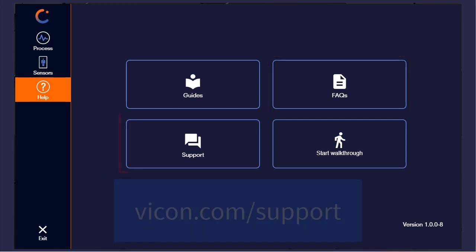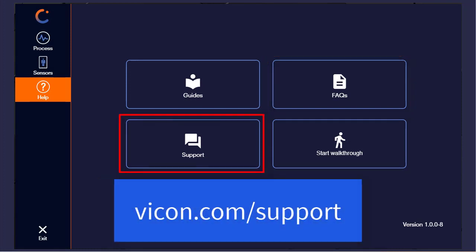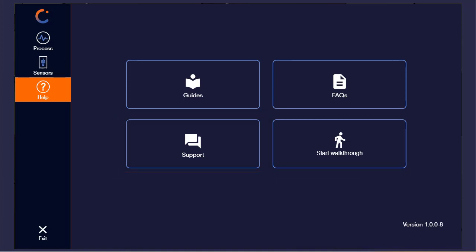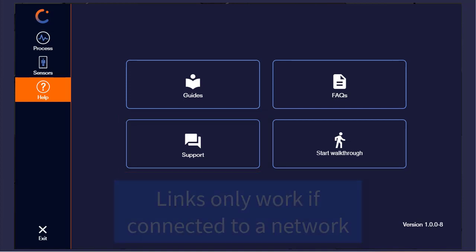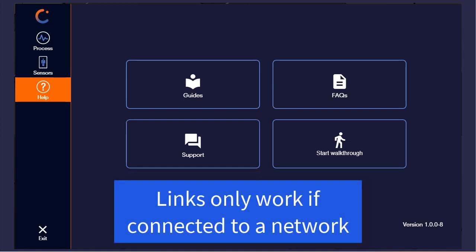And finally, clicking on support will take you to the support page on our website. Please note that you must be connected to the network in order for these links to work.